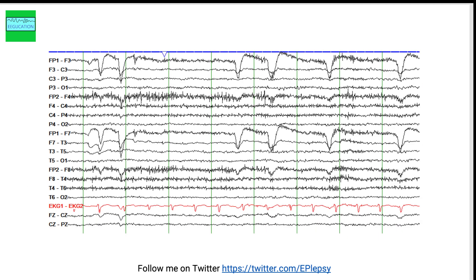This next EEG shows an asymmetry in the eye blink artifact — eye blink artifacts are seen in the left hemisphere but not in the right hemisphere. This is something examiners like to ask about. This person had a prosthetic right eye, which is the reason for the asymmetric eye blink artifact.